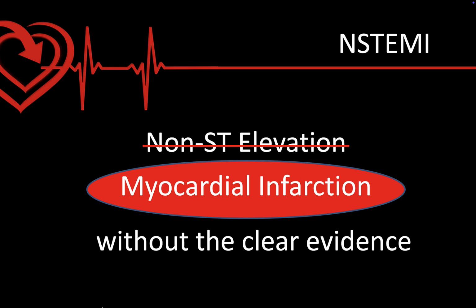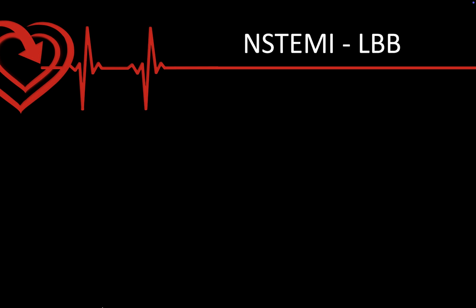In many systems, STEMI, ST elevation MI, is the only criteria that's going to get you a straight trip to the cath lab or to immediate intervention. However, we can still use these tools to heighten our awareness and increase the chance that we're going to verify an actual MI even without that clear evidence.